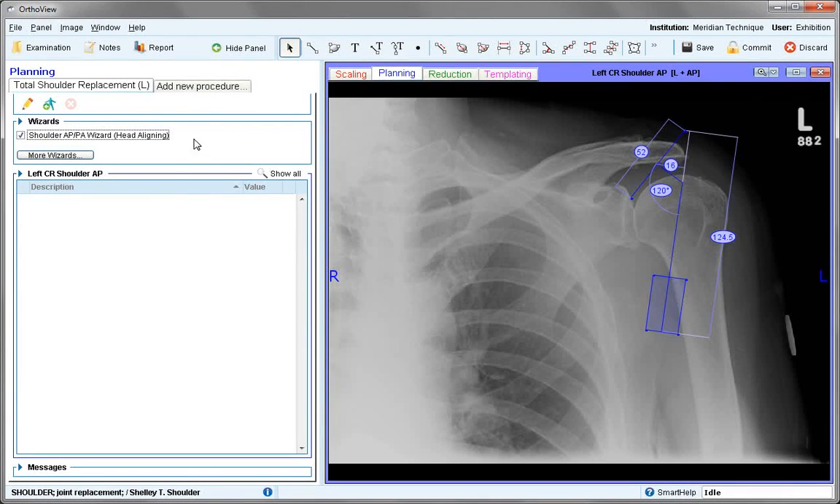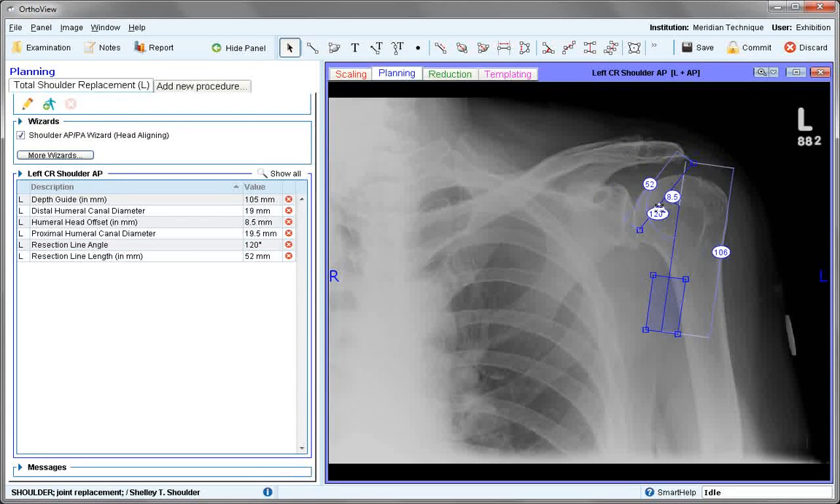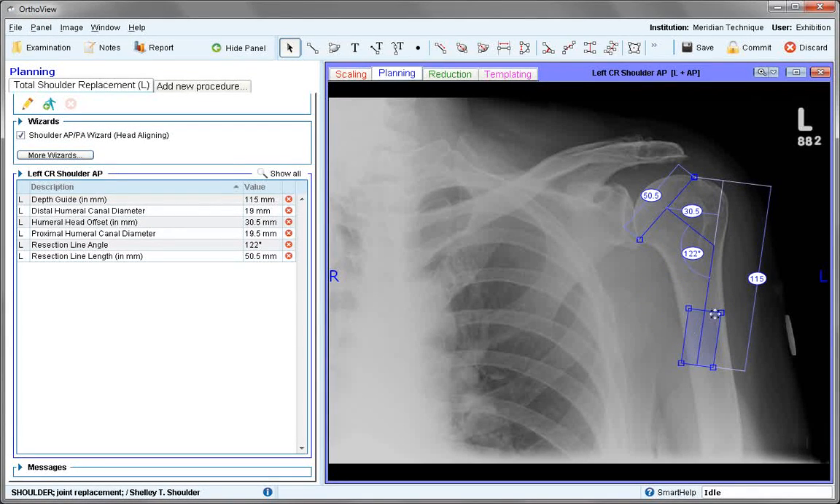This wizard is designed for head aligning systems. If you are not using a head aligning system, it may be easier to position manually and not use the wizard. The two square handles should sit across the extent of the articular cartilage, and the rectangular box should sit within the humeral shaft inside the cortex. The lower two handles define the recommended template width, and if the manufacturer's guidelines suggest a depth for the prosthesis, this can also be determined by the lower handles.